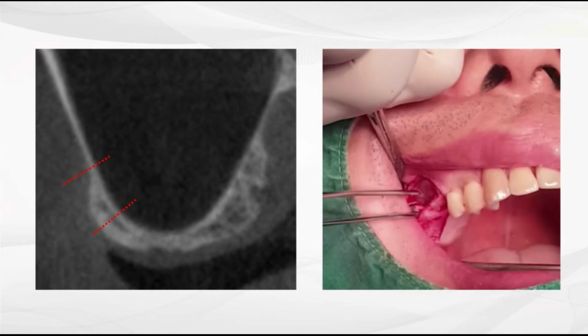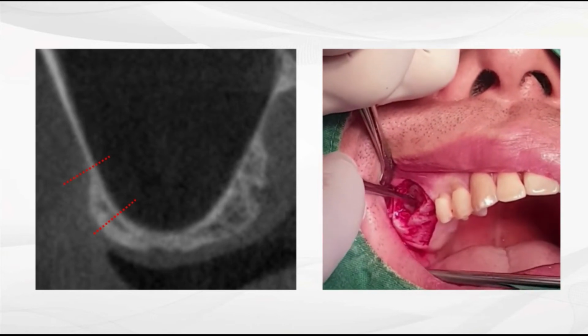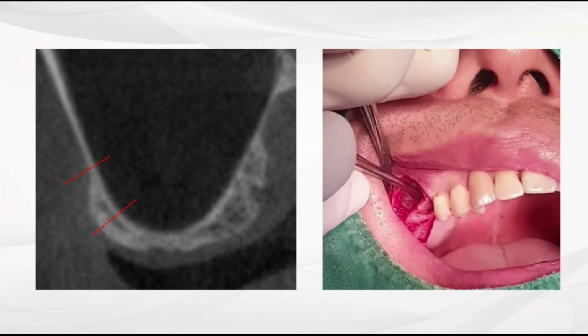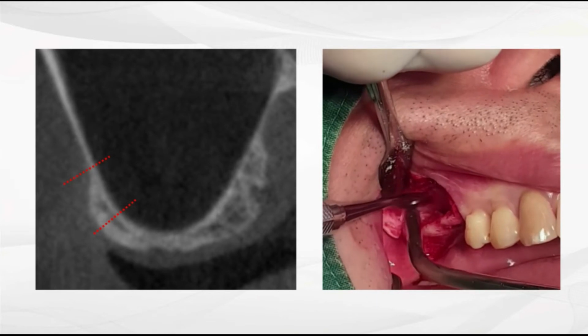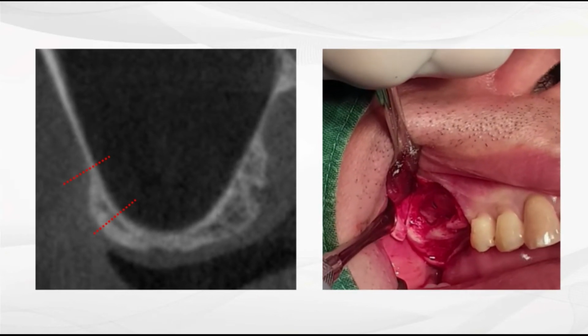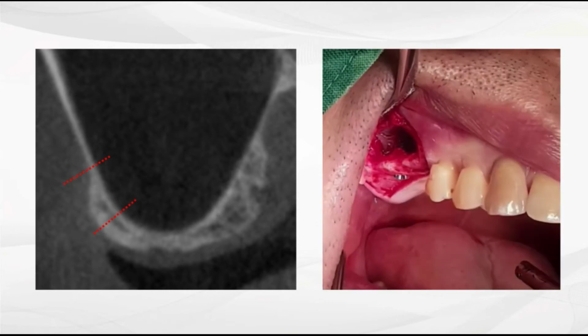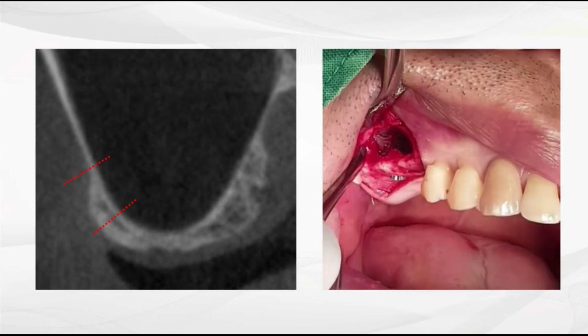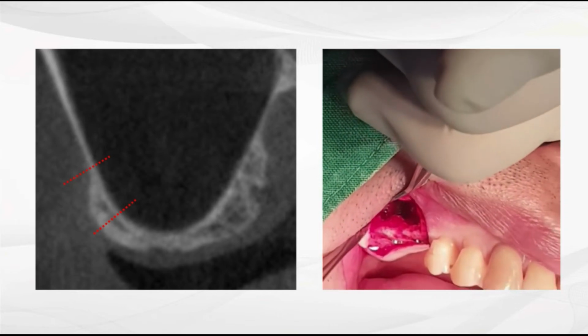During the removal of bone, the sinus membrane was lacerated. However, fortunately, this rupture did not hinder the membrane elevation. Watch the movement of the membrane along with the patient's breath, and then place the implant engaged in the sinus floor and below the elevated sinus membrane.